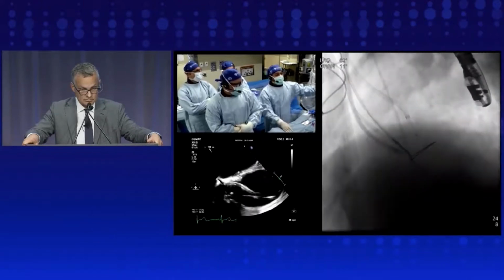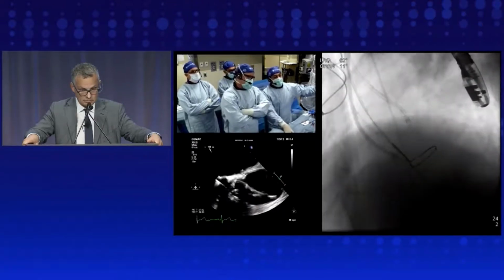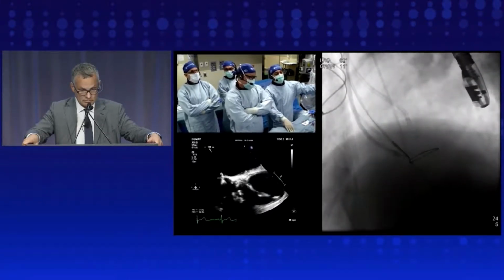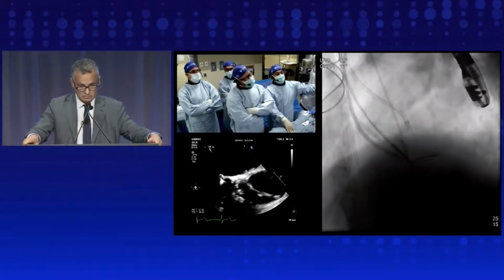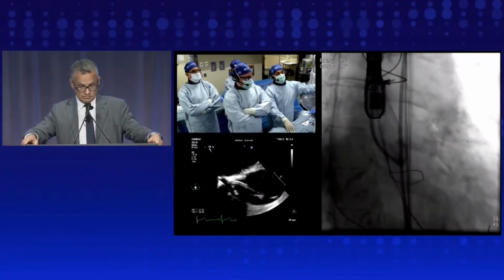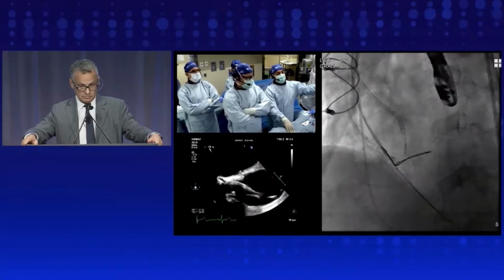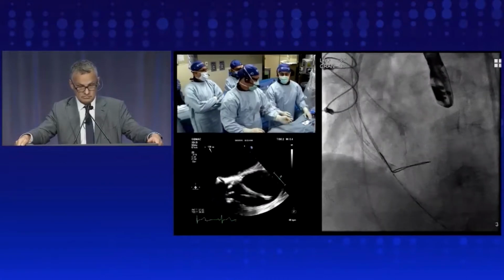So for that second leaflet, that's more or less the side view of the right cusp. You can see an 8 French multi-purpose. That's the darker gray catheter that you see on the screen, positioned, and we have another snare now waiting in the LVOT. Positioning picture, that's more or less the front view. We want to see that you are in the center of the cusp. And basically, this is where we are right now. So maybe we'll just go ahead.